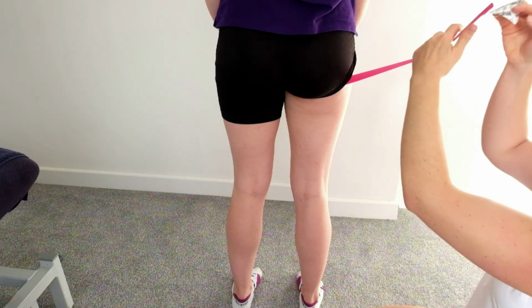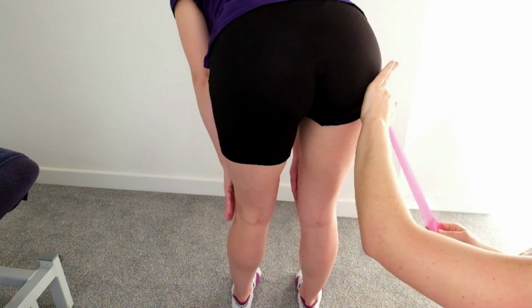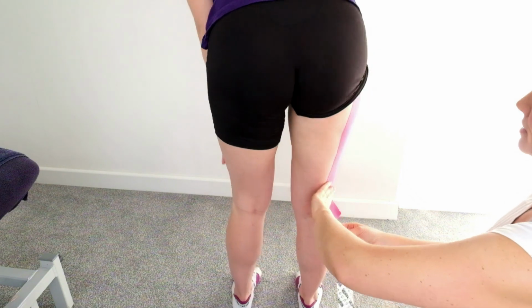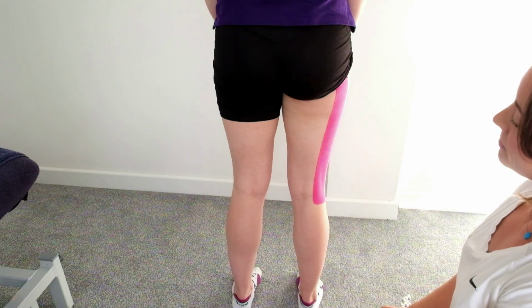I peel back the tape, I add a light amount of stretch, and I get my client to put the target tissue on stretch, so flexing and rotating away from me. And I lay that tape down, rubbing it well with a light amount of tension. And the base, the last inch or two with no tension and no stretch.